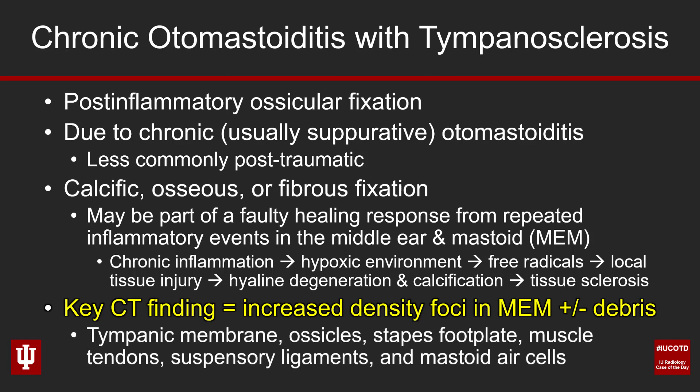Where does tympanosclerosis specifically affect? Think about the sound conduction pathway — those are the structures involved. It can involve the tympanic membrane; if it involves only the tympanic membrane, we call it myringosclerosis, which is a subtype. Much more commonly, I see it involve the ossicles, the stapes footplate, and the muscle tendons like the stapedius or tensor tympani, as in this case. Another great place to look is the ossicular suspensory ligaments — the marionette strings that hold up the ossicular chain. It can also involve the mastoid air cells with increased density.